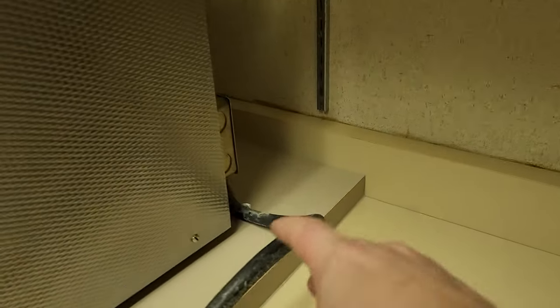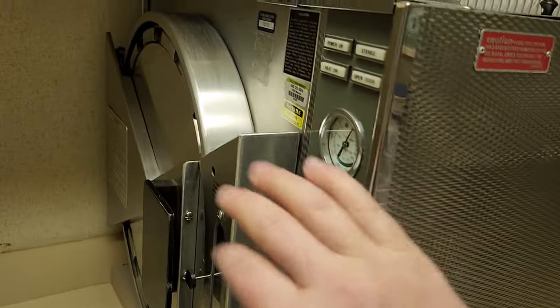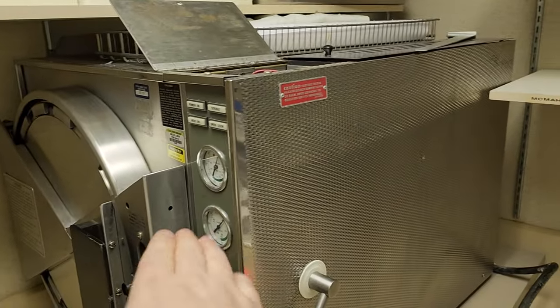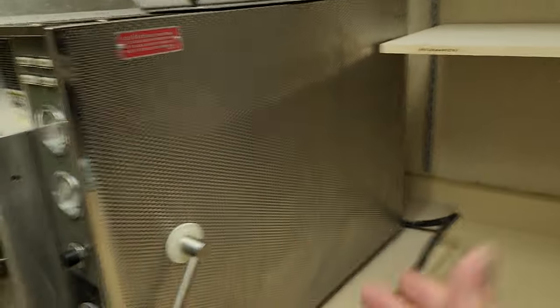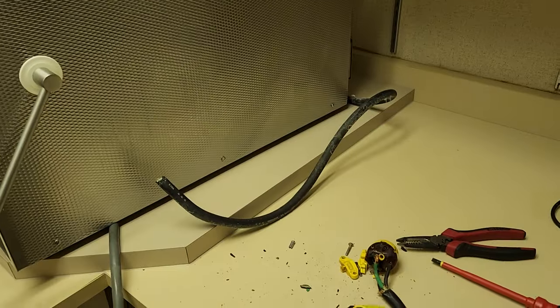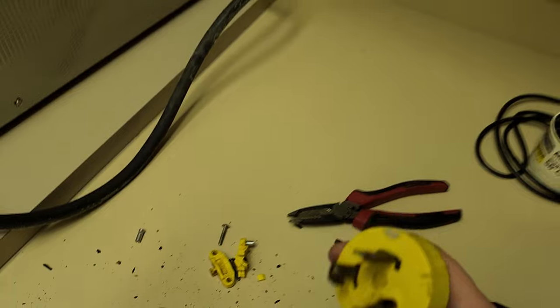That's why whenever there's refrigerators or something, I always encourage people to put something back here as a bump stop, because just normal use, it's normally oriented this direction here. So people putting stuff in it, it just naturally wants to scoot backwards. Even with the amount of mass that it has, it just naturally wants to scoot backwards. And here we are. So now I have to find me a new plug.